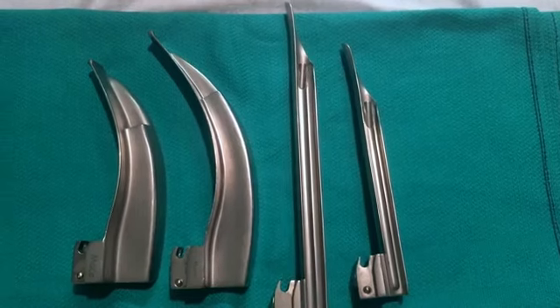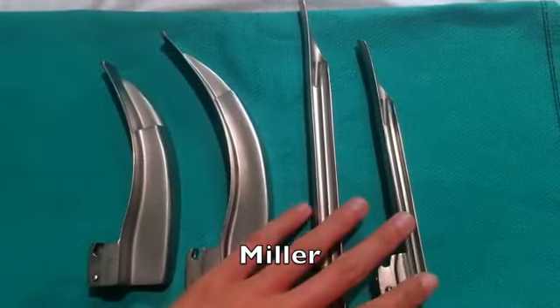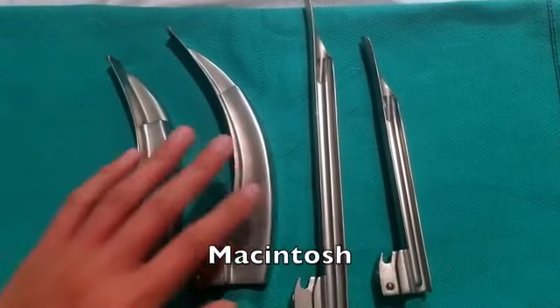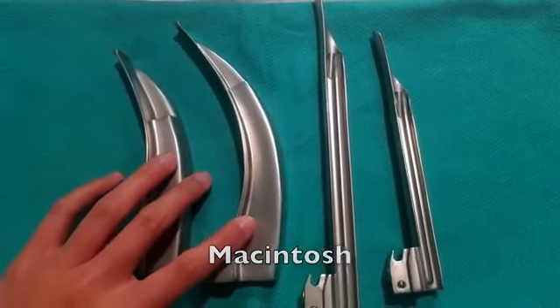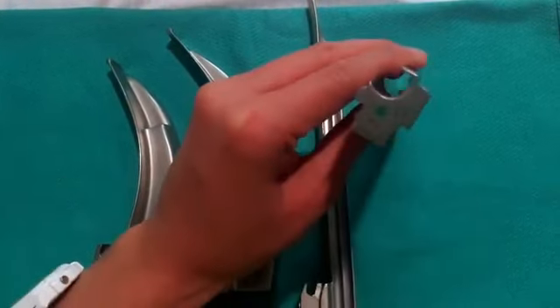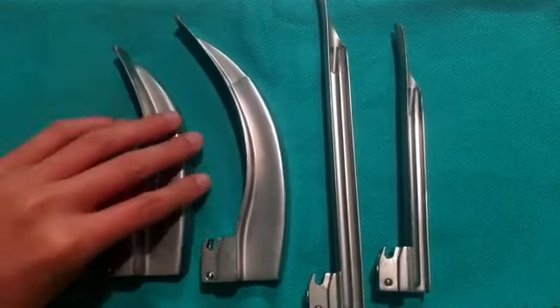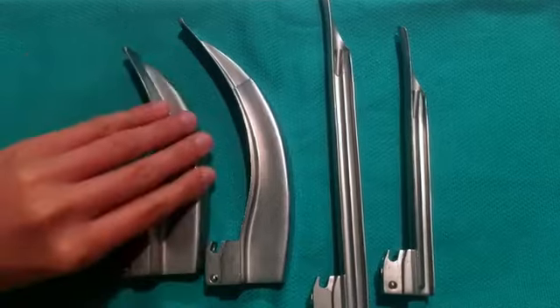I'm just going to talk about the different types of blades that we use in anesthesia. There are Miller blades, which are here on the right, and then Macintosh blades, or Mac blades, on the left. A typical average size for a Miller blade is a 2, which is this one, and this is a size 3. And a typical average size for a Mac is a 3, which is this one, and this is a size 4.